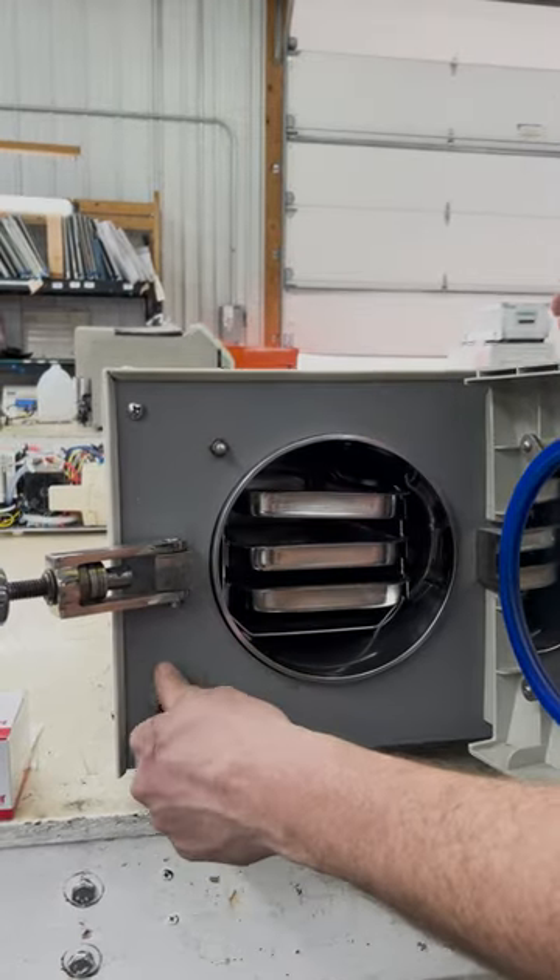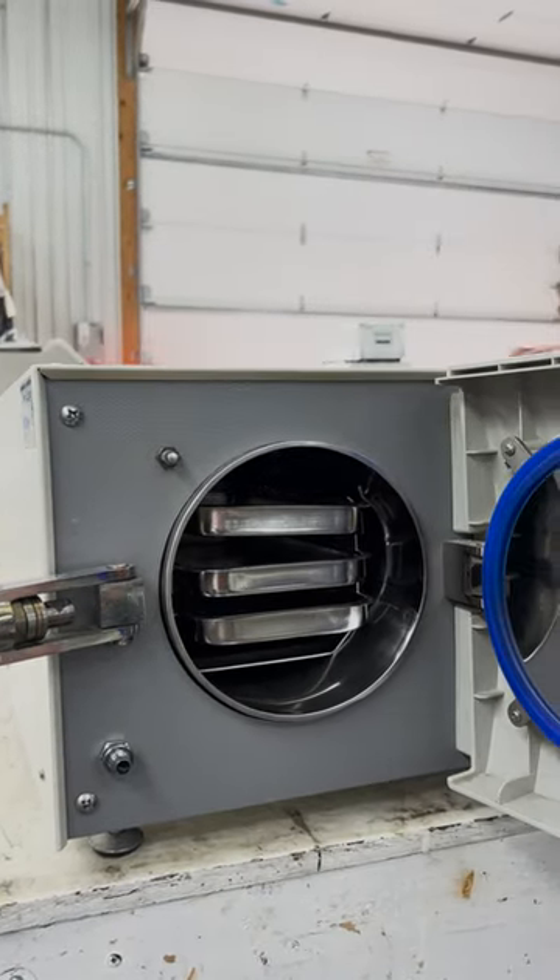Tighten that back down, refill your reservoir, and you're good to run cycles again.